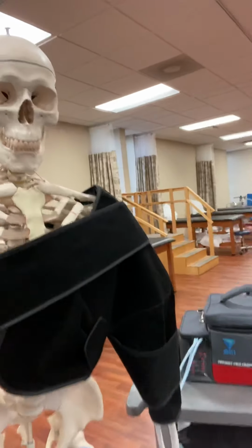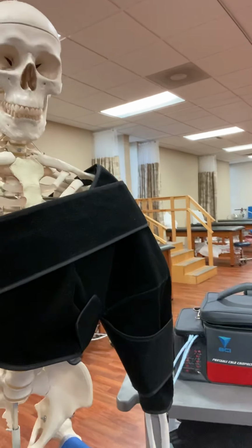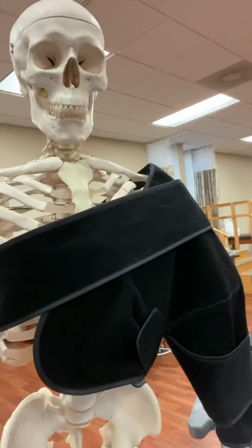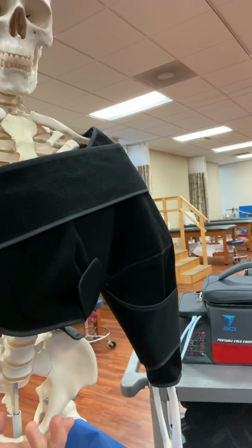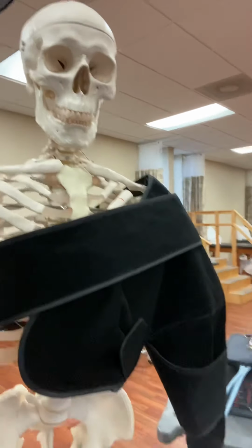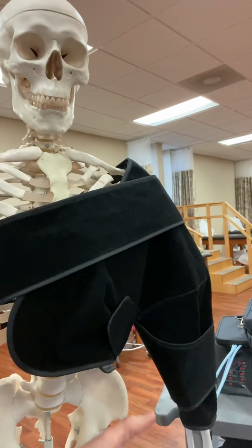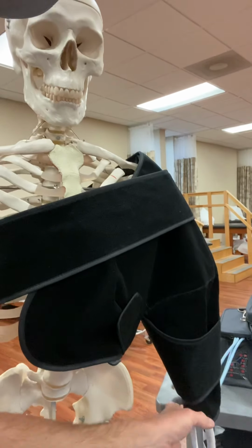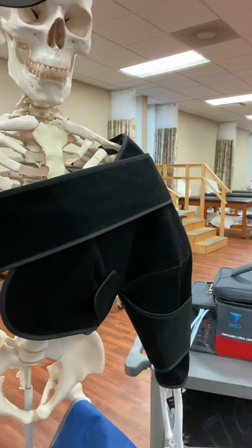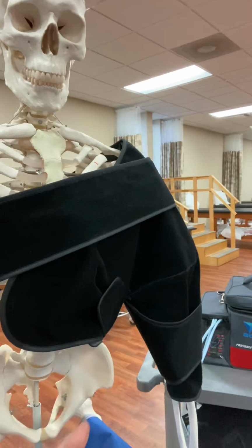And what you're going to see is, first of all, the upper extremity device. Now, our textbook teaches that you're going to use an upper extremity device, and I actually have the shoulder one on here for possible use with a shoulder type injury. But there are also other specific cuffs that we can use that would go distal to that and possibly be used for lymphedema. And we're going to talk about that here in a minute.